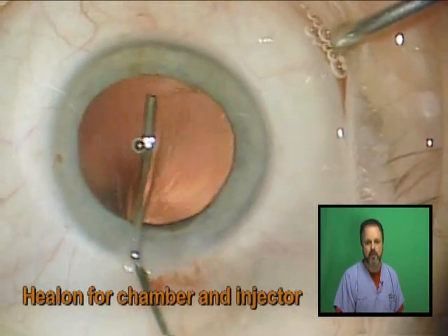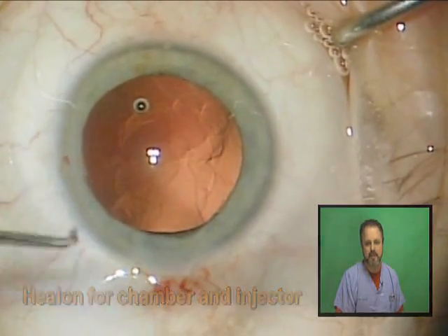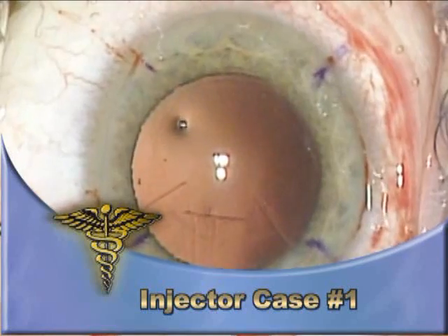Next I fill the capsular bag with viscoelastic and I insert the 5.0 lens with the MTC injector cartridge provided by IONX. Now let's take a look at a few examples of lens insertion.